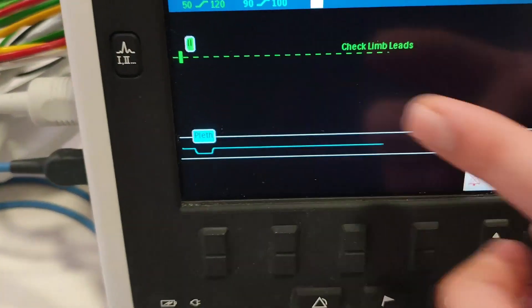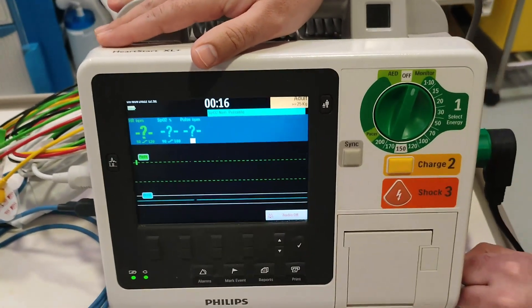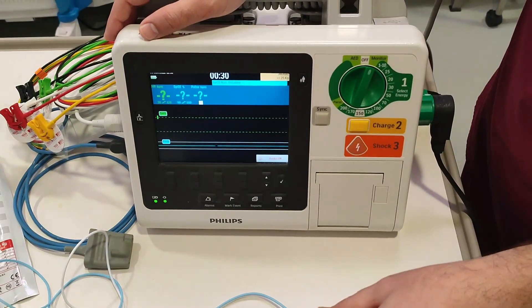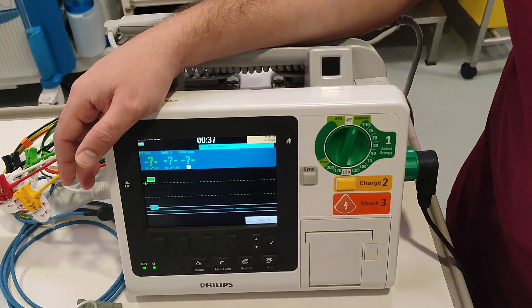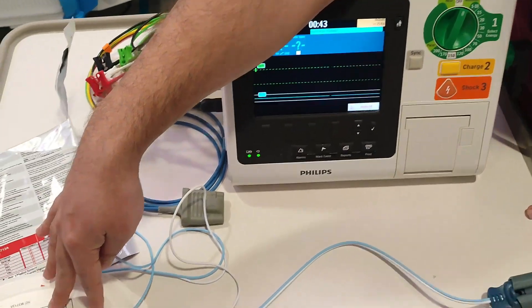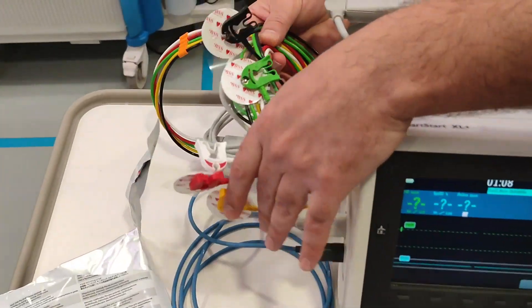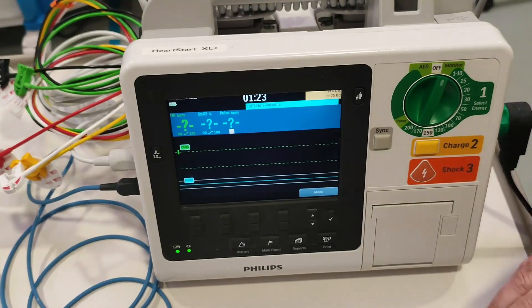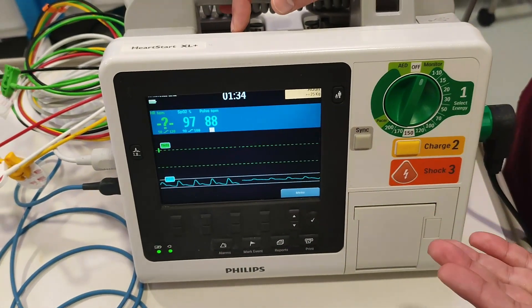You can see it here on the regulator. Let's turn on the machine — it is turning on and there is an ECG on screen. You can change the lead from here. Now it is on the pad mode, so this defibrillator machine is detecting the ECG through the defibrillator pads. When attached to the patient, it will read the ECG. The benefit is that during emergency or cardiac cases, we can directly deliver a shock from these pads and also perform pacing.